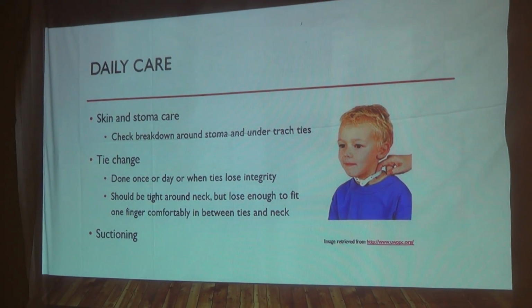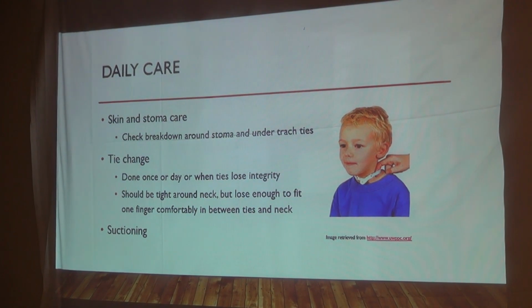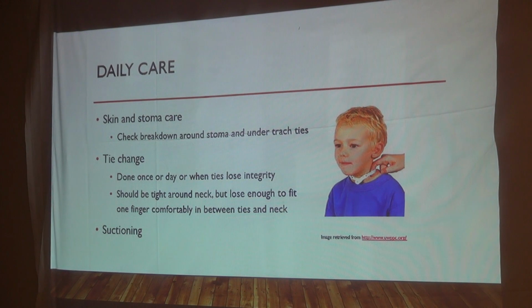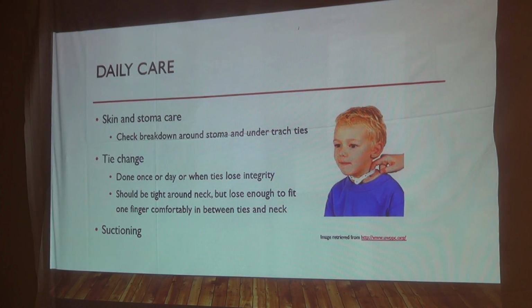So daily care, I know you don't perform daily care in the ED necessarily, but just to kind of review the basics of it. Skin and stoma care, so you're going to check for breakdown around the stoma and under the trach ties. This is important with any trach assessment because you want to make sure that there isn't any breakdown. It could be a source of infection for the kids.